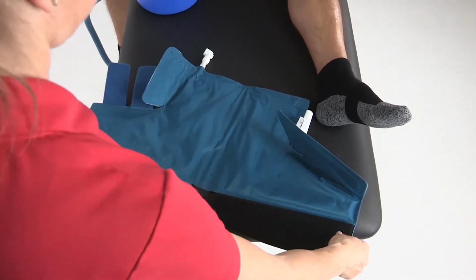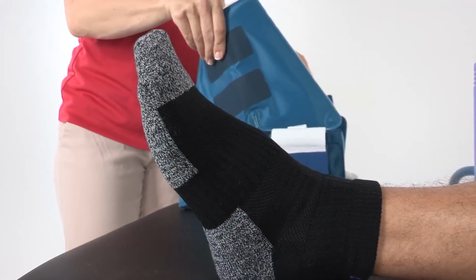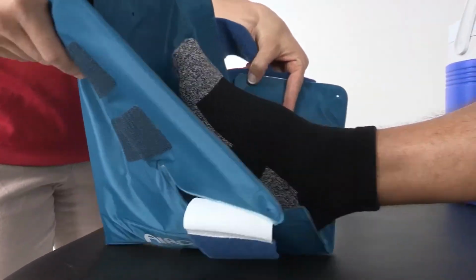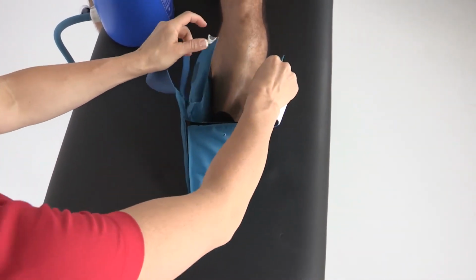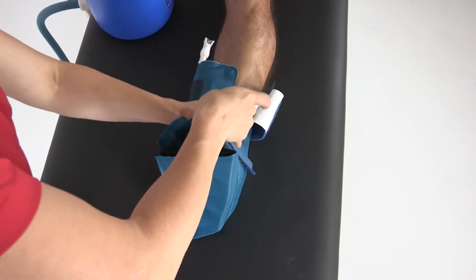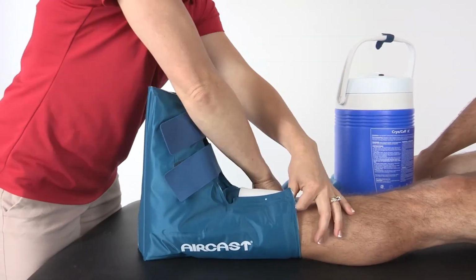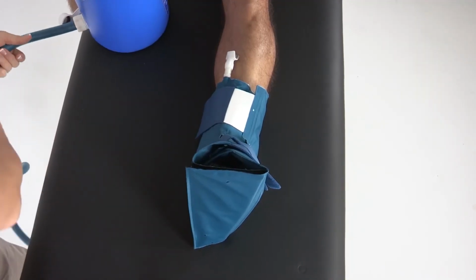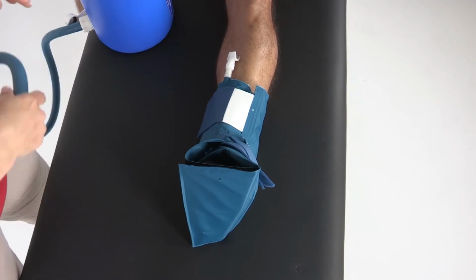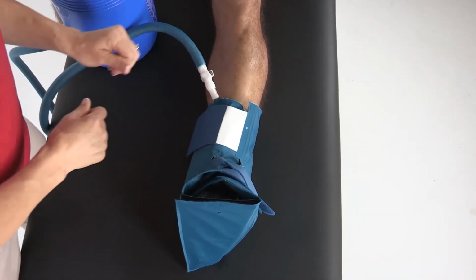Close the bottom flaps under the foot. Position the foot inside the cuff with the heel pressed against the back. If needed, adjust the cuff width by repositioning the bottom flaps. Wrap the foot cover around the foot and secure with straps. Then wrap the ankle cover around the ankle and secure with straps. Do not use an elastic wrap in conjunction with the CryoCuff, and ensure any dressing under the CryoCuff is applied lightly.